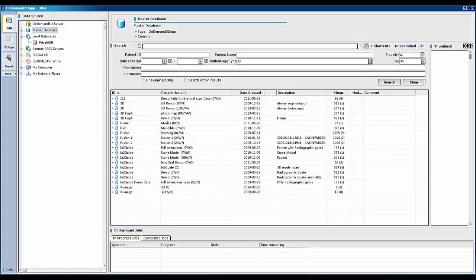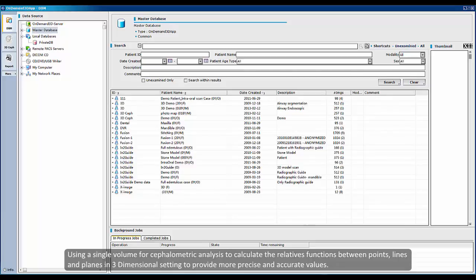Welcome to the video tutorial on on-demand 3D software. This video will cover the 3D Ceph module, particularly using a single volume for cephalometric analysis to calculate the relative functions between points, lines, and planes in 3-dimensional settings to provide more precise and accurate values.